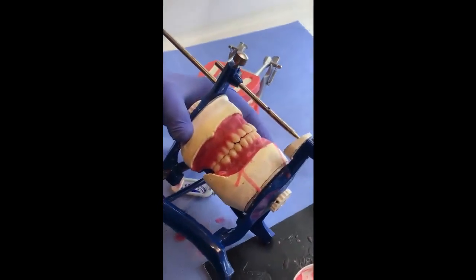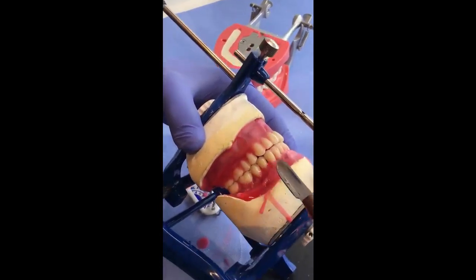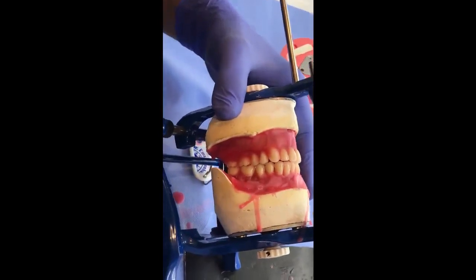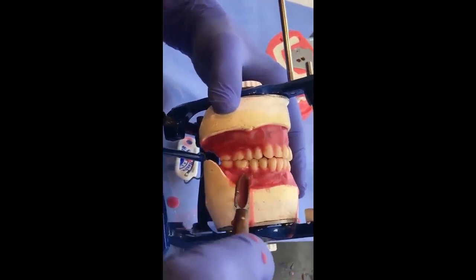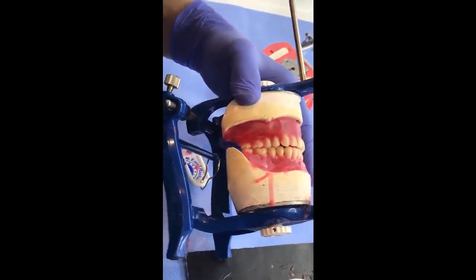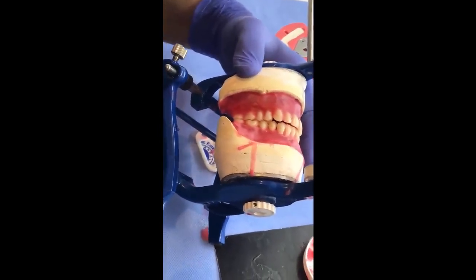You can prepare the pieces of wax as much as you need. And here I'm adding wax to the buccal surface of the lower. And you can notice that I'm putting the wax at the gingival third of the teeth, without any voids, and we have to fill the interdental spaces so we can carve the interdental papilla.